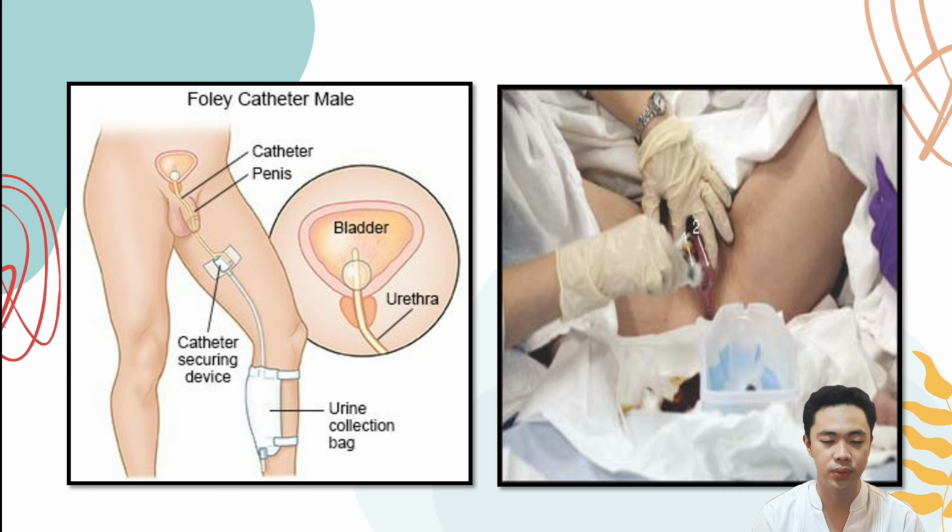Cleanse the meatus. Note that the non-dominant hand is considered contaminated once it touches the client's skin. For women, use your non-dominant hand to spread the labia so that the meatus is visible. Establish firm but gentle pressure on the labia. The antiseptic may make the tissue slippery, but the labia must not be allowed to return over the cleansed meatus. Note location of the urethral meatus is best identified during the cleansing process.